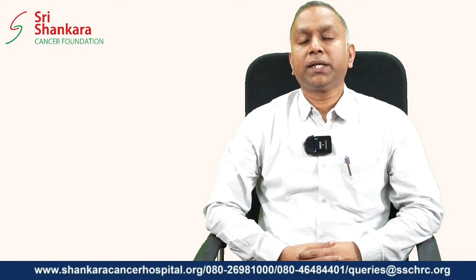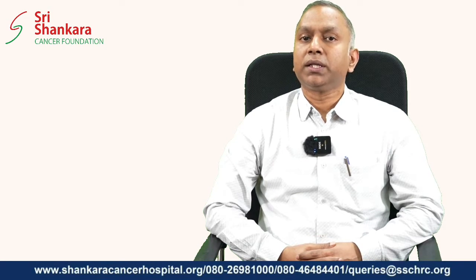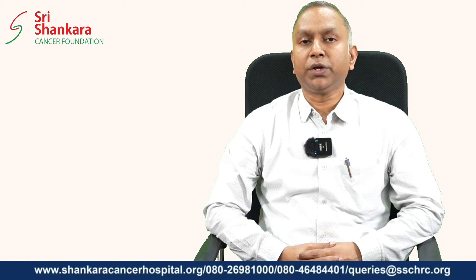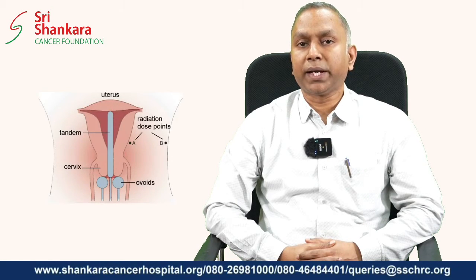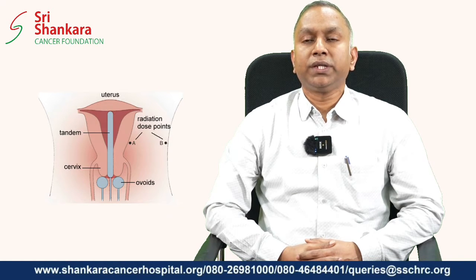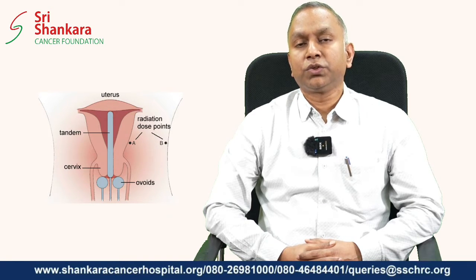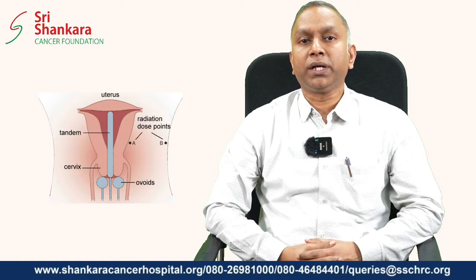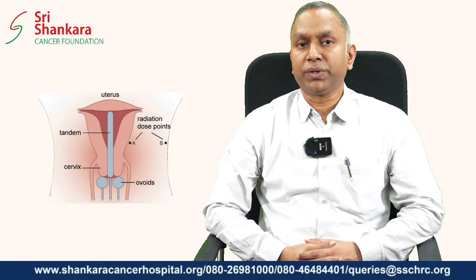Brachytherapy can also be divided into different types based on the location or the type of organ where we are using the radiotherapy. For example, there is intracavitary brachytherapy, commonly called ICBT. In this, applicators are kept in the cavity of the organs. The most common area where intracavitary brachytherapy is done is carcinoma cervix.